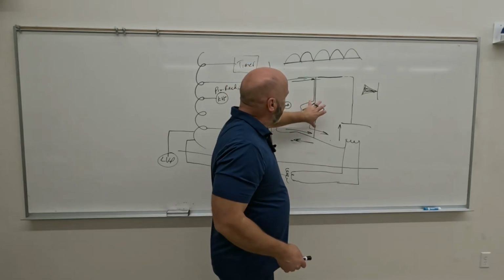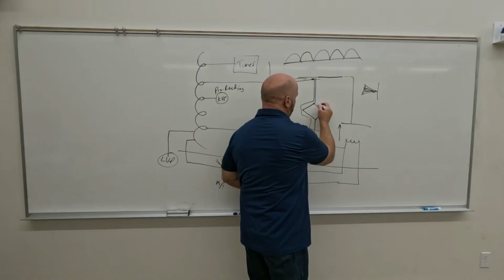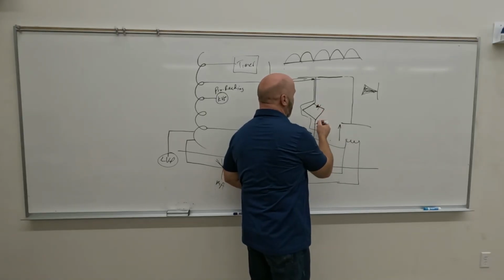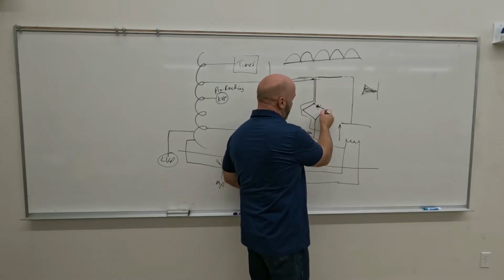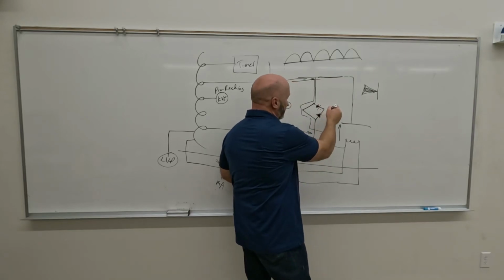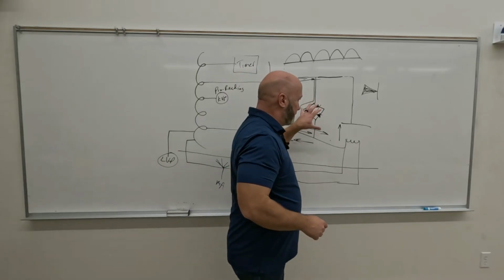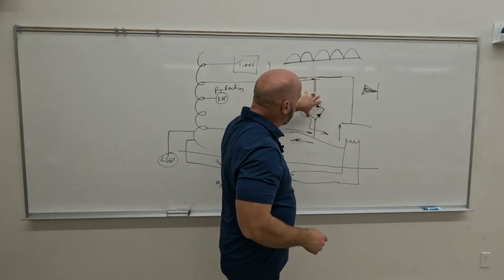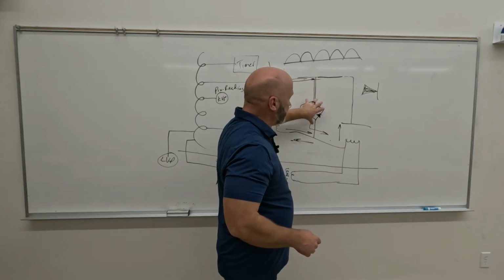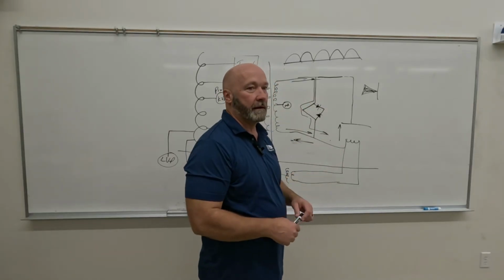If you see this diamond in here, I'll go ahead and kind of draw it. But again, I'm going to hit one wrong, and what I'm going to have is like this. I'll have electricity just kind of bouncing around in this one little area right there, and it's not going anywhere. Some diagrams will put all 4 rectifiers just kind of in this diamond little area right there. It's all the same thing.